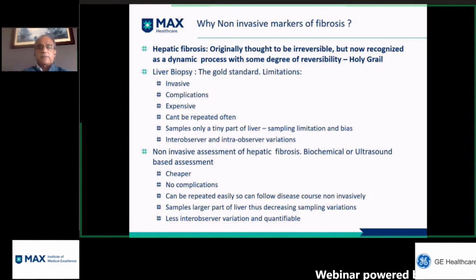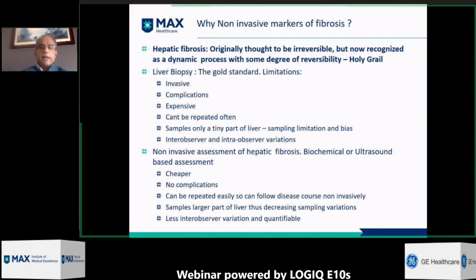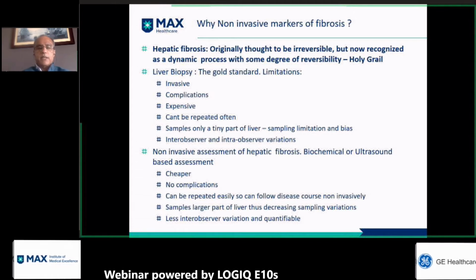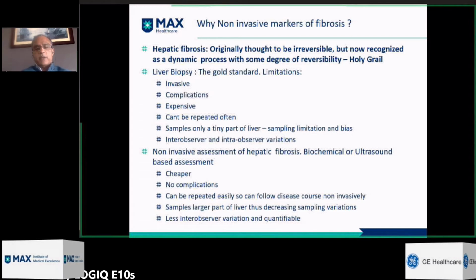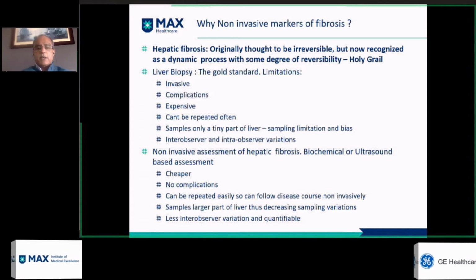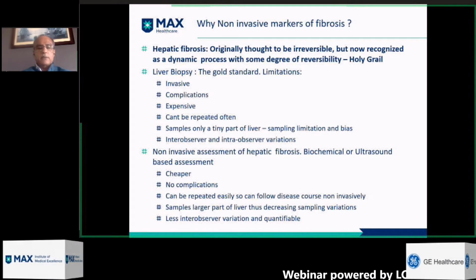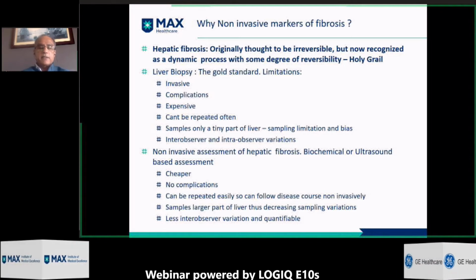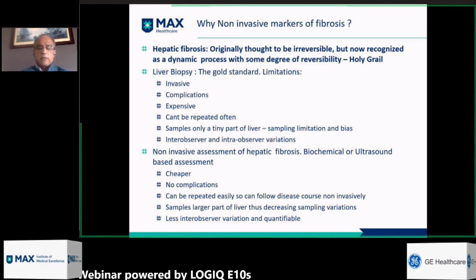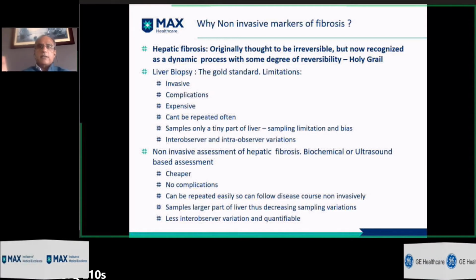So unlike a fatty liver assessment on visuals by the ultrasonographer, mild, moderate, severe, or grade 1, grade 2, grade 3, this gives us a quantifiable number, which is also important from a patient care perspective. Because when we tell a patient who has come in, for example, with non-alcoholic fatty liver disease, that your CAP values are 400, 350, and your stiffness is say 8 or 10 kPa, and that if you do the right things, we may be able to see improvement in these parameters.